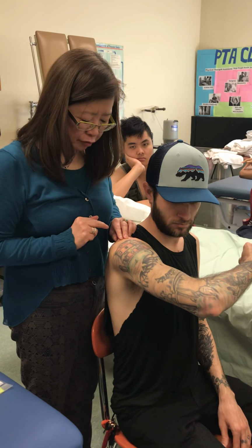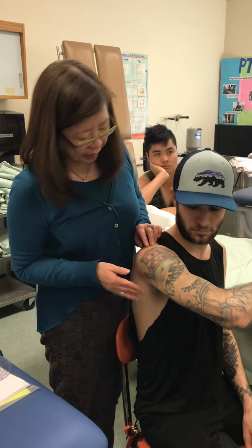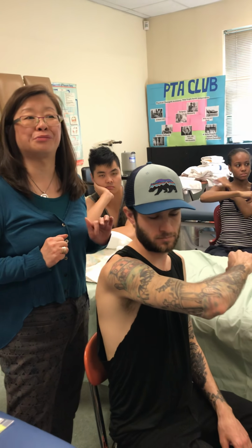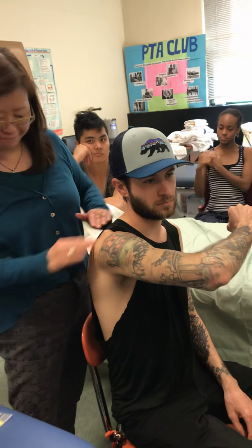What would I be using for my proximal? Where should it be lined up to? Trunk. Yeah, the top part of his trunk, using the base of the neck.